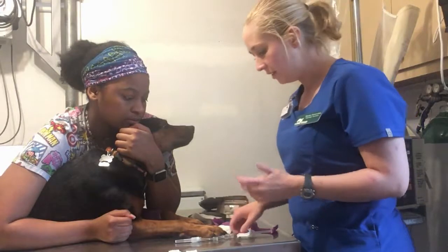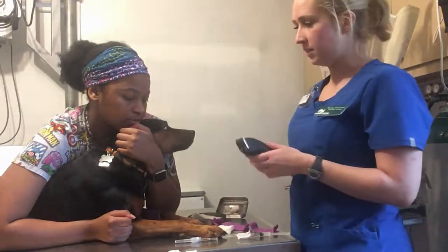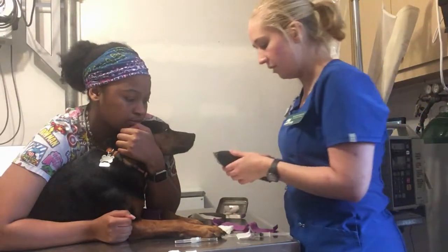Okay, so I'm going to be placing an IV catheter. The first thing you're going to do when doing the catheter is shave the area.